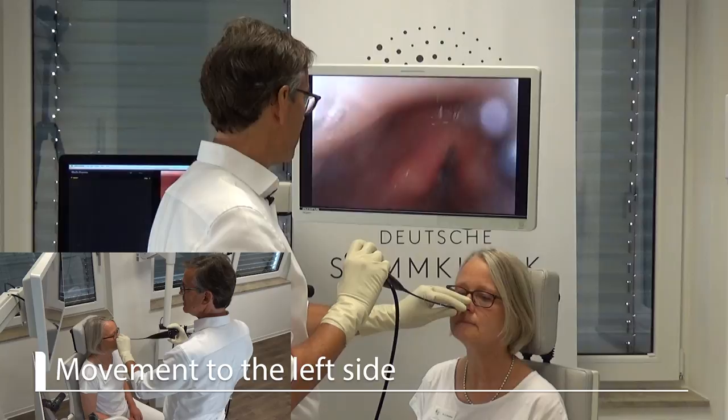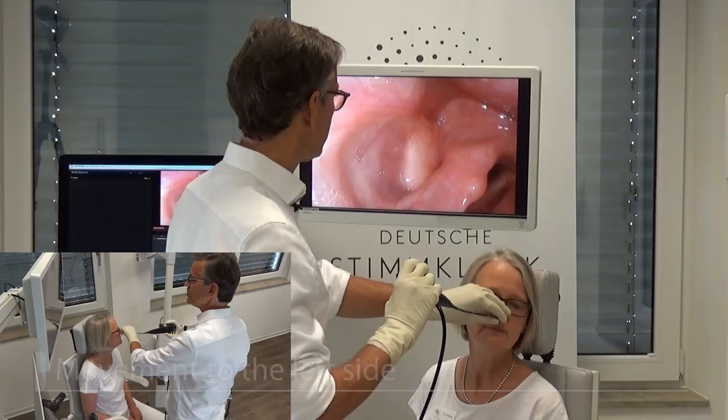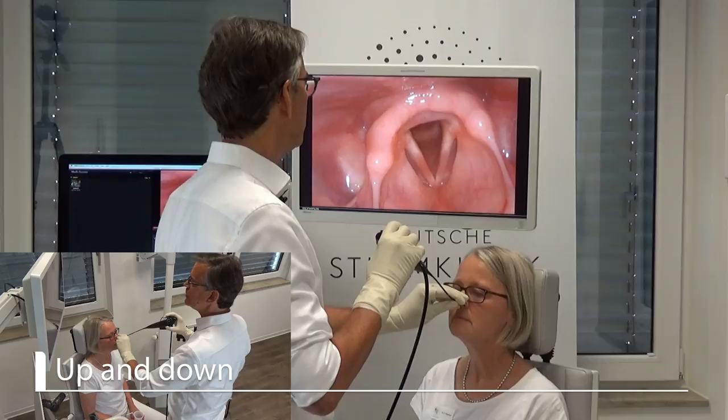Let's have a look at what happens when she rotates her head to one side. I can look into the piriform sinus on the right side. When she turns left, the other side is a little bit squeezed, and if she turns the other way, this one opens up and the other side is more closed and squeezed.